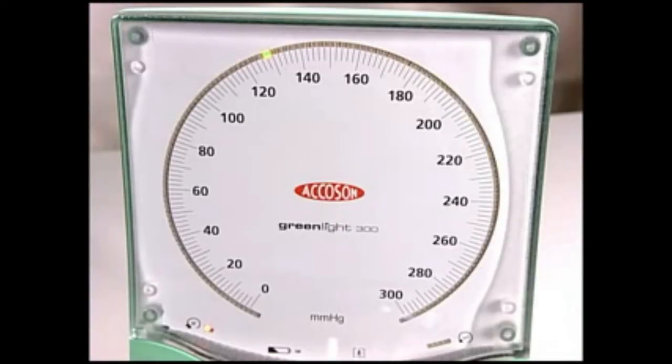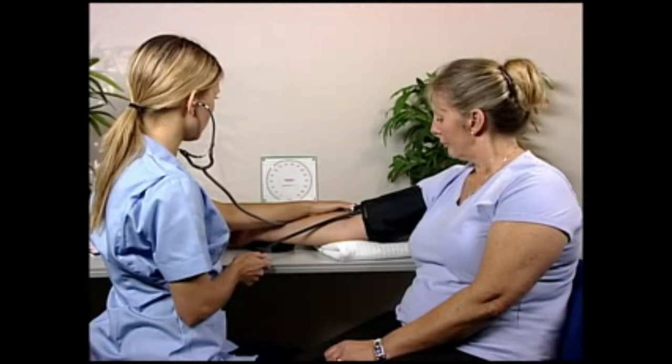The GreenLight 300 clearly displays cuff pressure in steps of 2 millimeters of mercury using a series of bright green LEDs, making it easy to comply with the American Heart Association guidelines.